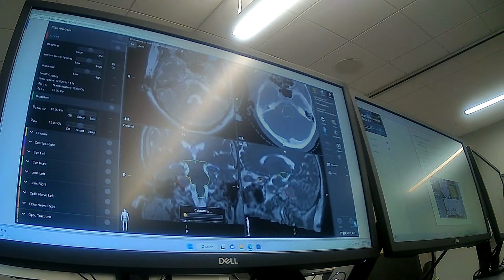What did the reflection balls? Definitely. We found out everything. Also, that is kind of bananas. Yes. But I won't let you move this one. So it just has to be used. I'll let you guys use this one. It'll go on the very step. Move this button.